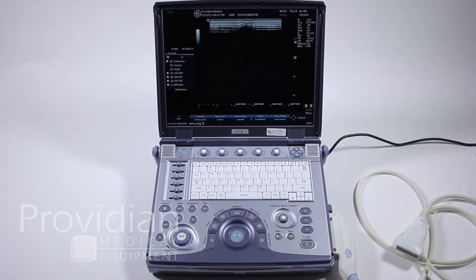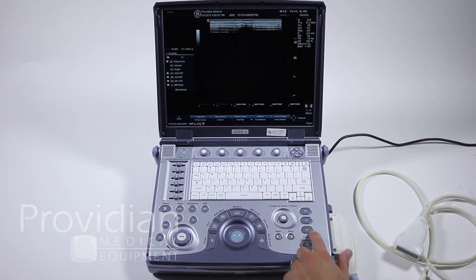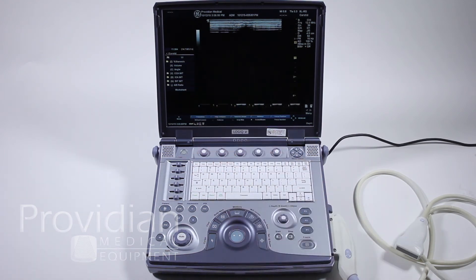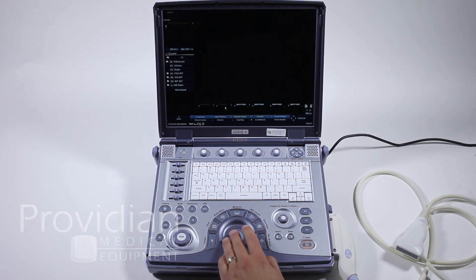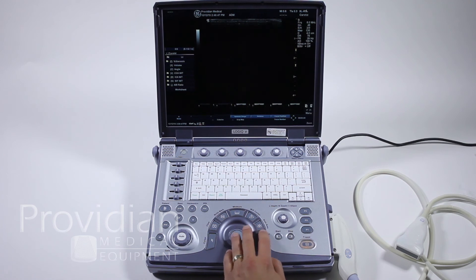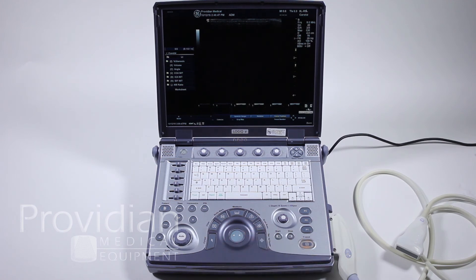How this is set up depends on the utility menu — it'll indicate how many seconds you want to save. In system setup you can set it to save the last three seconds, ten seconds, or whatever you want. Or, if there's an ECG attached, how many seconds before and after a certain number of heartbeats. As shown in the first video, with those clips you can click on them, review them, store them, go to the active image pages, or delete images you don't want. You can export them later — if you have useless images, you obviously don't want to save those to the patient or add hard drive space.